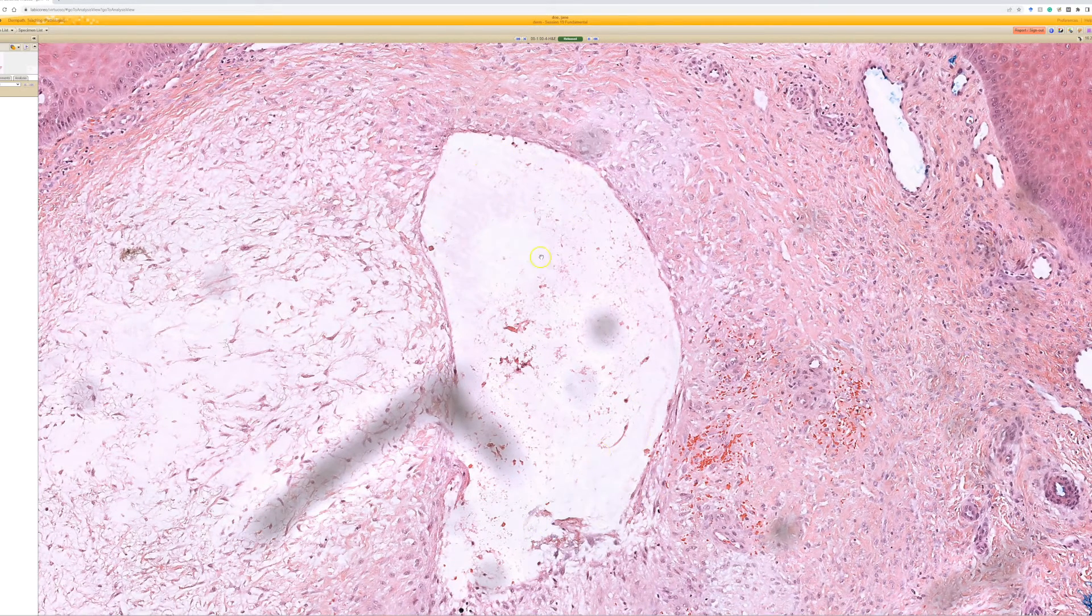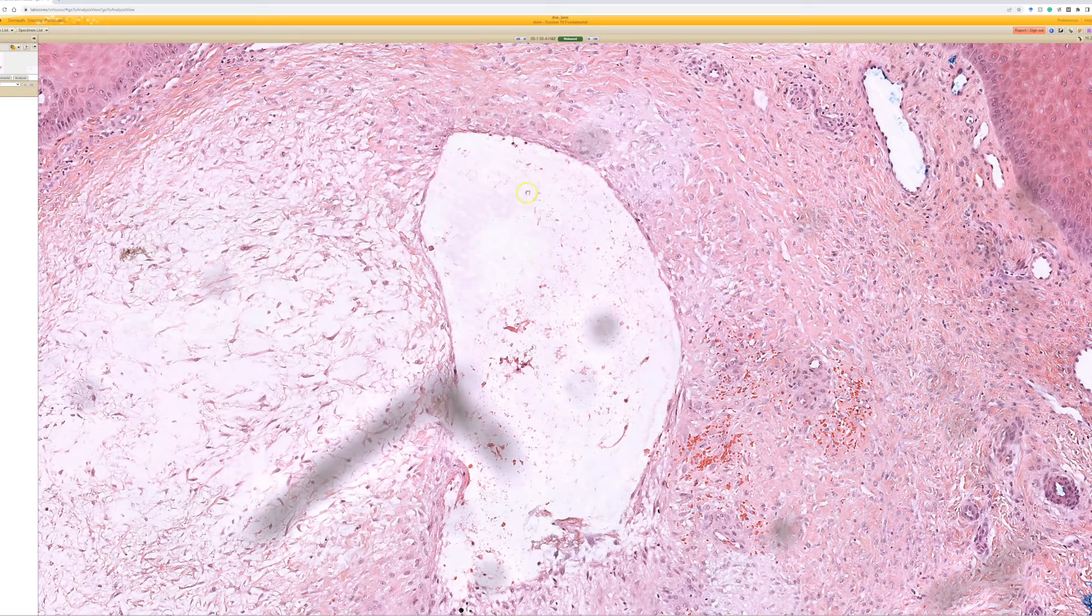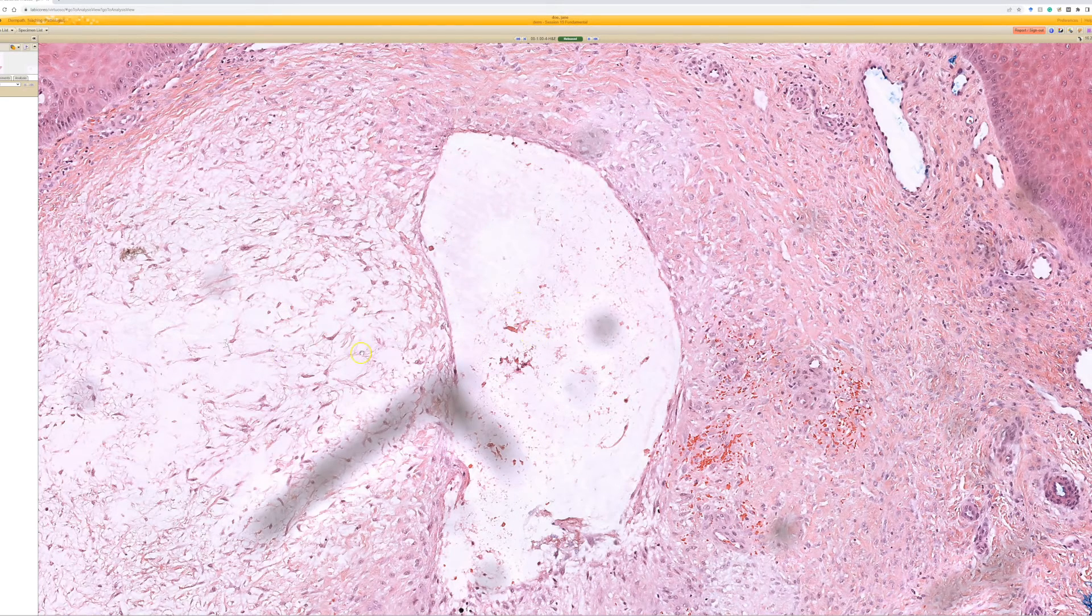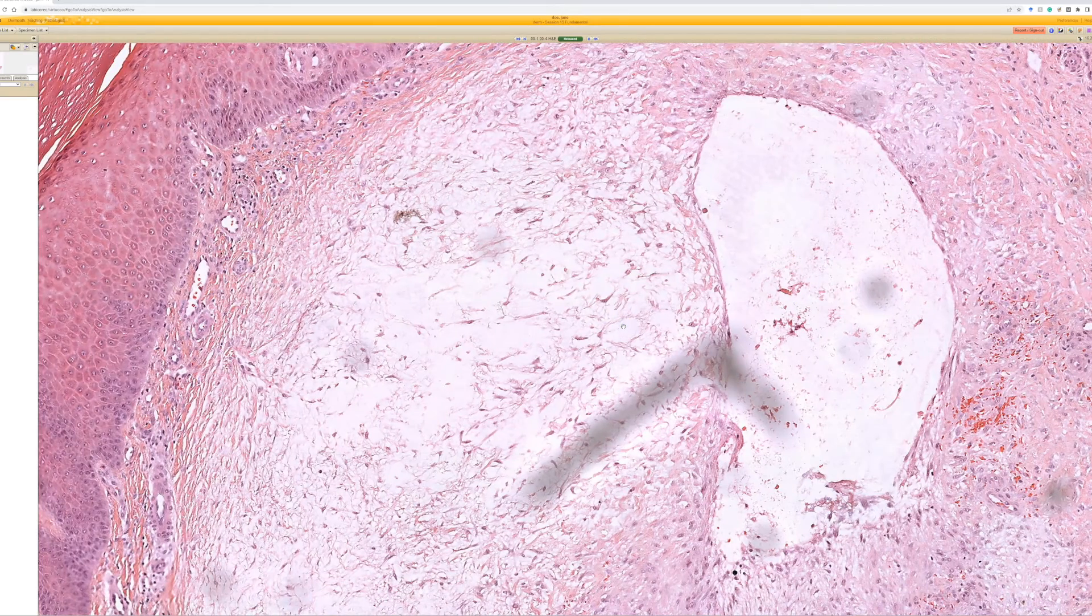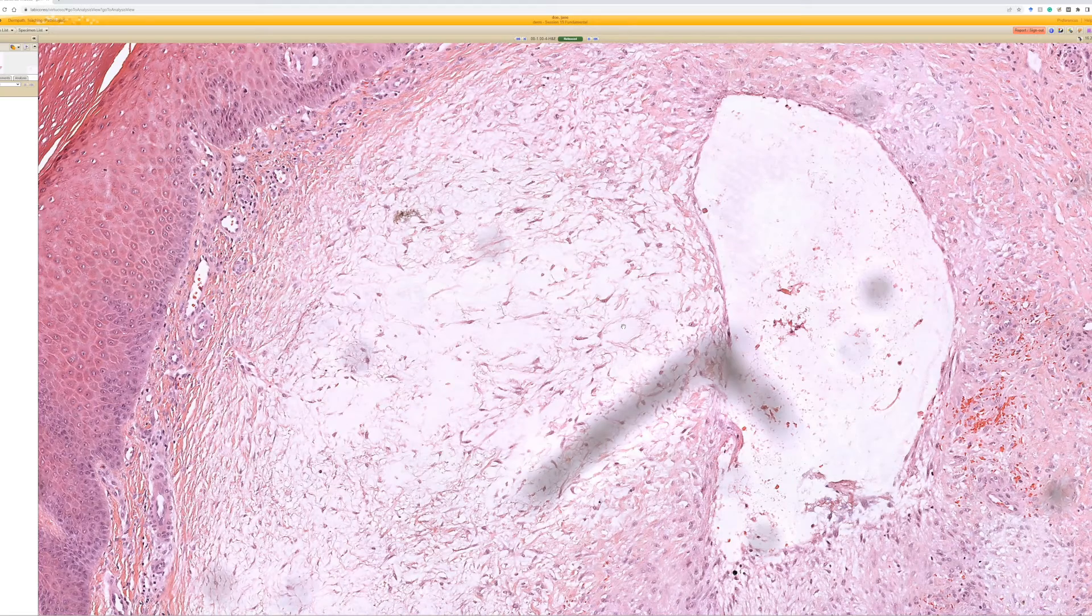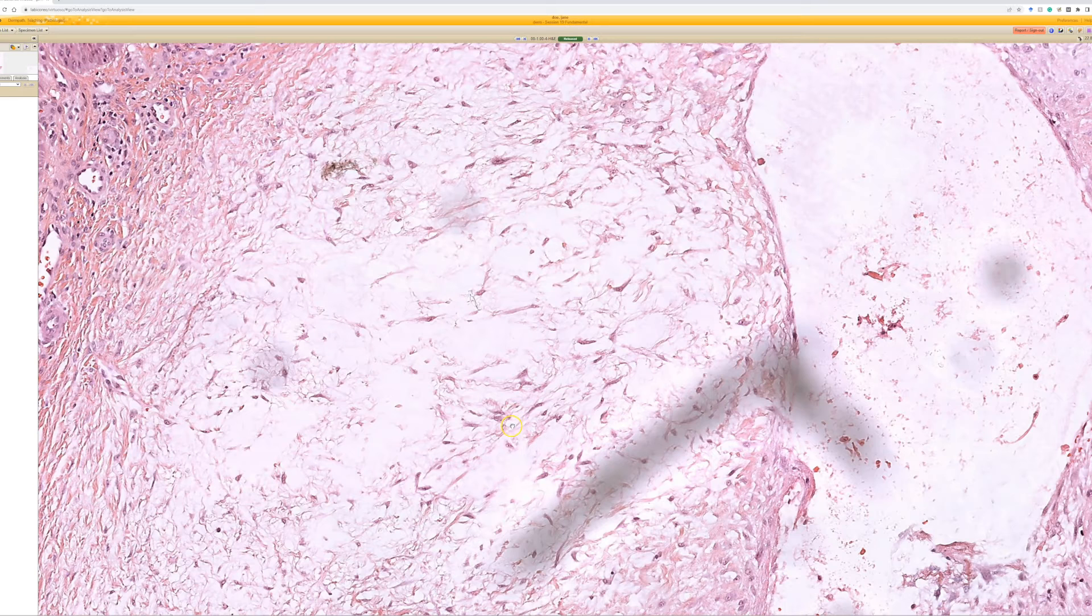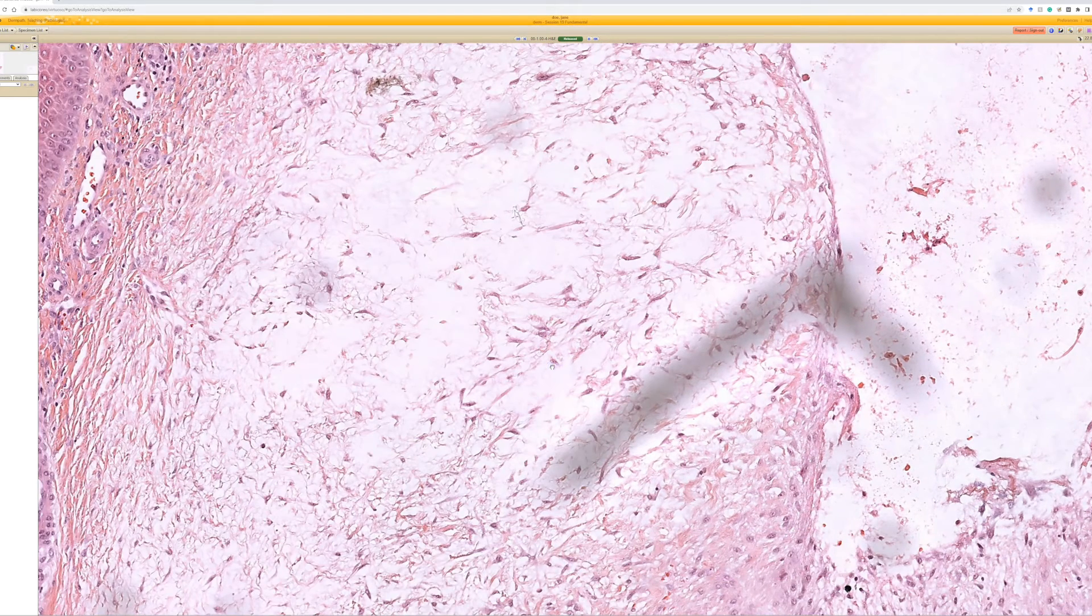A pseudo-cyst filled with mucin or mucoid material or washed out and empty. Number two, though, what happens is sometimes the mucoid mucinous material leaks out of the cyst and infiltrates the adjacent dermis. And what you get then is this loose mucoid pale dermis with floating spindle to stellate fibroblasts or myofibroblasts floating around in that mucinous material.